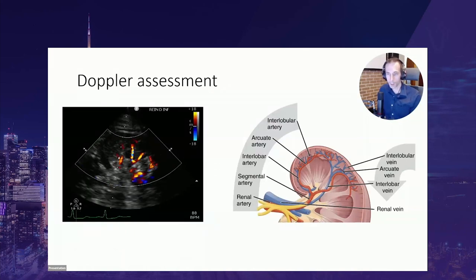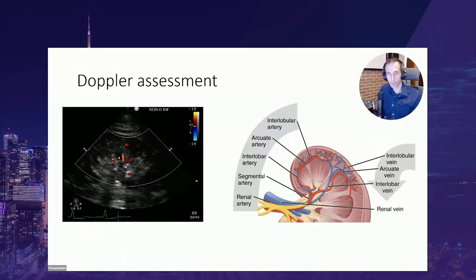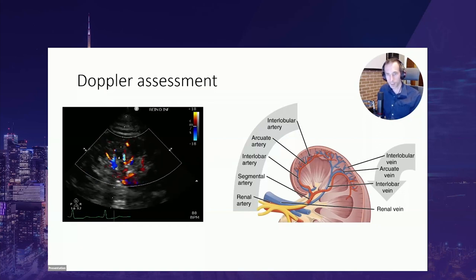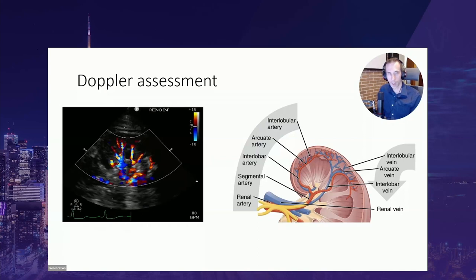When you turn on color Doppler, you can identify the normal vascular nature of the kidney. When the signal is good, you can usually identify the segmental arteries, the interlobar arteries, and the interlobular arteries. The interlobar arteries and veins are usually located between each of the pyramids of the medulla.